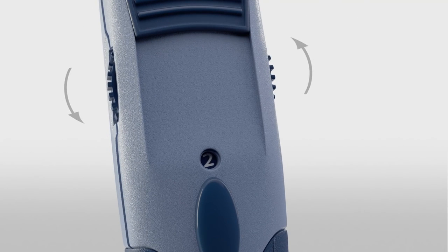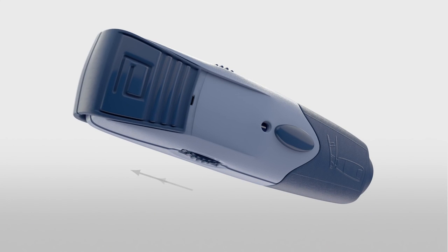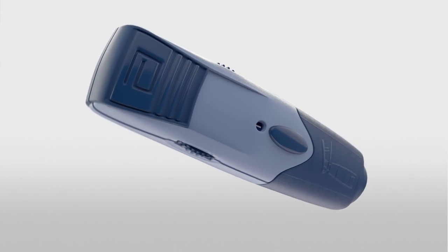Move the dial to the desired setting of the lancing depth. Begin on 1 for the shallowest setting, and increase the dial if more depth is needed. Finally, pull the handle out until it clicks.